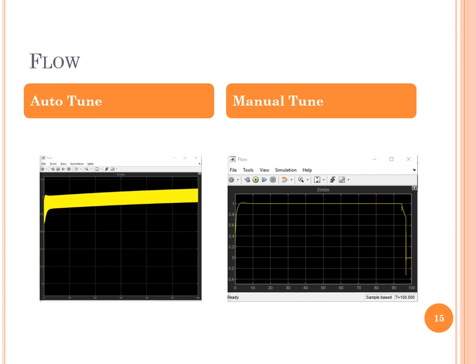And on the right side, the figure shows the response of the flow PID controller after manually setting the weights. It shows a better result. The system reaches the desired flow in a matter of seconds with little overshoot and keeps the flow constant until the motor is turned off.